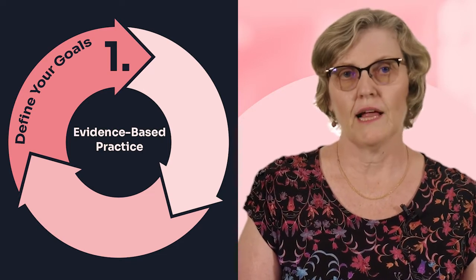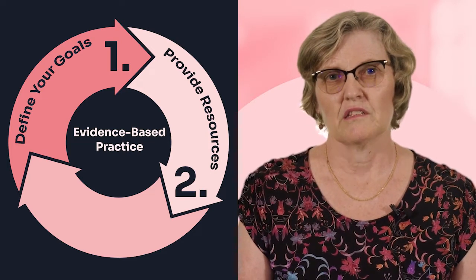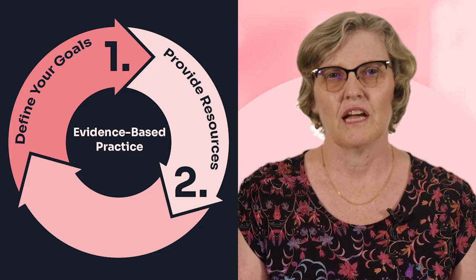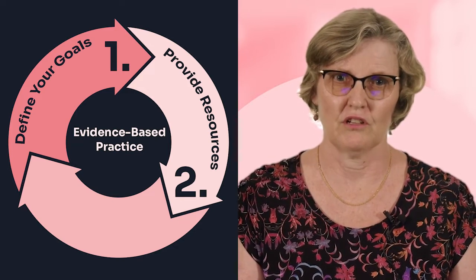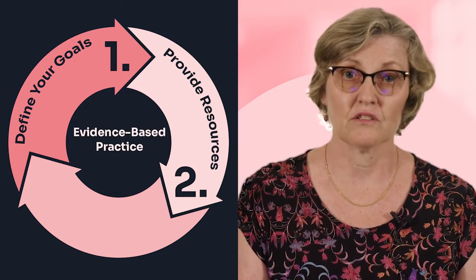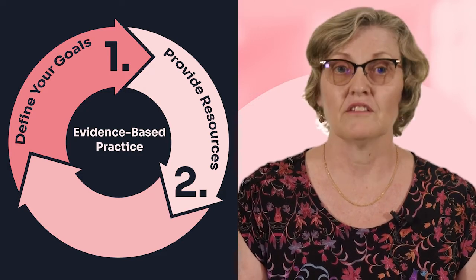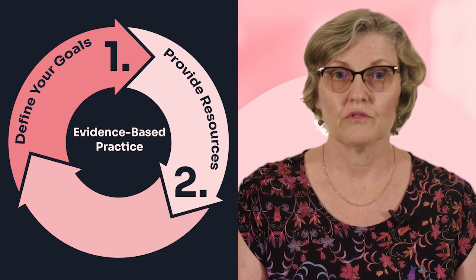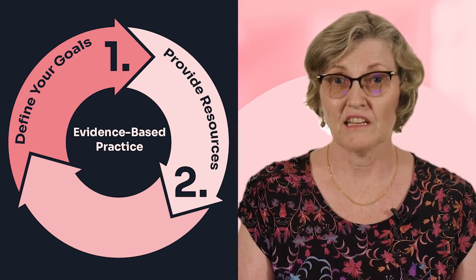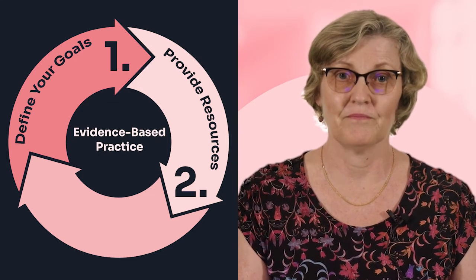Well, I've got my goal, how do I get there? It's about providing resources. It's about providing the guidelines at the bedside for all staff and providing education for the guidelines. Providing education when the evidence updates, like the 5-second scrub for the needleless connectors, you tell your staff, it's changed. It's important that they know that. Provide ultrasound machines and training, especially in areas with high incidence of cannulation, such as ED.